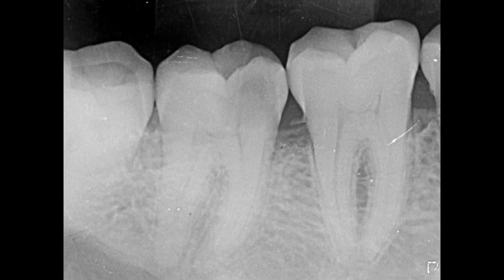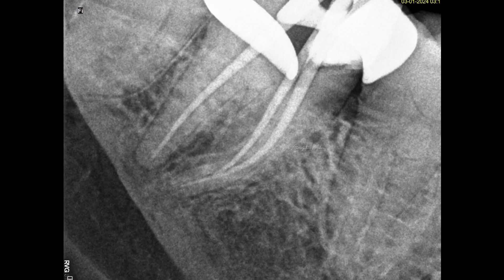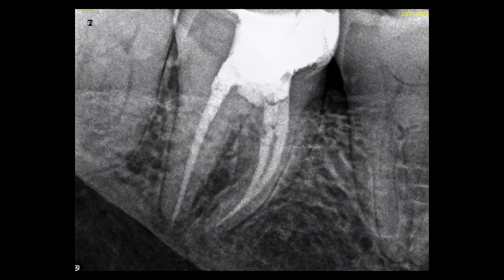The third case was comparatively easy — I could breathe easy because it did not have a distoproximal cavity, which was very difficult to isolate during treatment. The canals were also not as close to each other as in the other two cases; they were a little farther apart. However, the canals were a little longer compared to the other two cases and also highly curved, especially in the mesio-buccal canal.